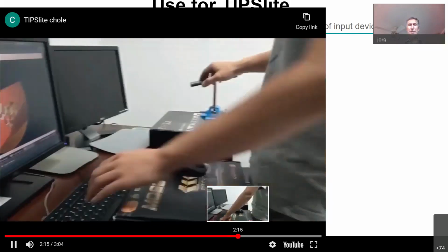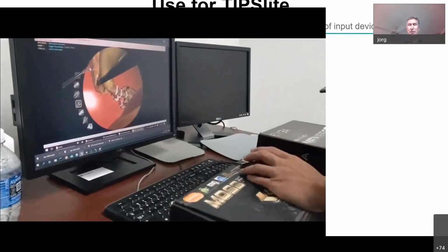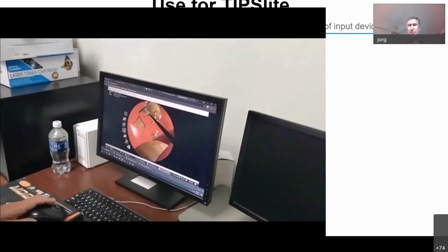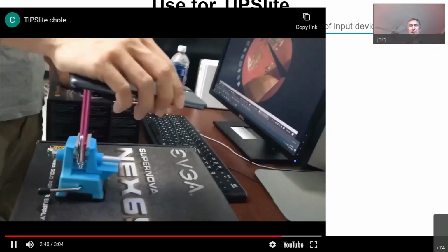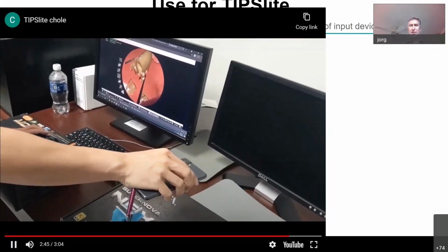Now we can change tools. In the meantime, we've changed the tool because it's a little awkward to reach down to the keyboard. But all the action that you see here is done by the cell phone. So the snipping of the cutting tool is by pressing the button. So it's hardly perceivable, the motion here with the hand. And the hope is that cell phones are sufficiently ergonomic.